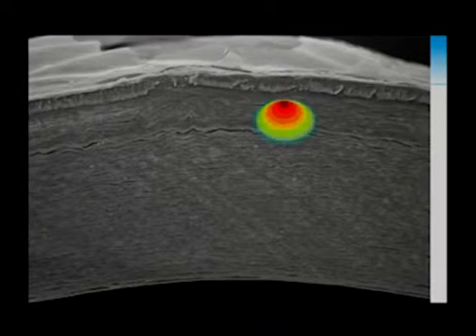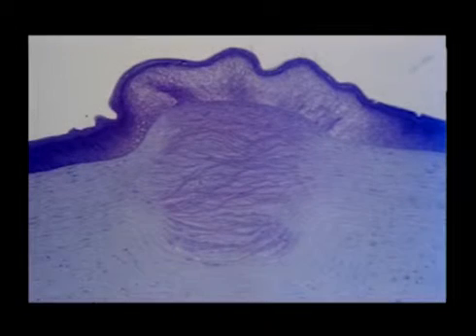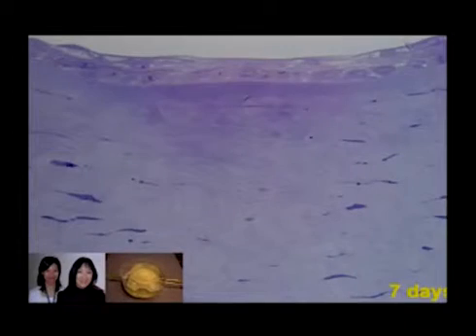Looking in an animal eye, you can deliver the energy. It creates a scar, as you see here. This is a very intense treatment. Here's the histopathology afterwards. Here's a human eye bank eye showing the types of energy we actually deliver to the human cornea, showing the intact epithelium with a mild scar formation just beneath in the anterior stroma.